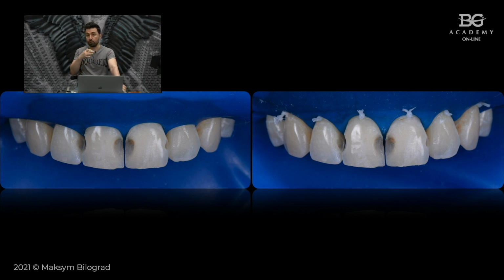at tooth number 21, you can see that tooth number 21 is a little bit wider than tooth number 11.